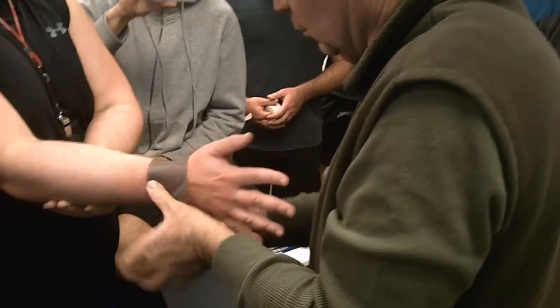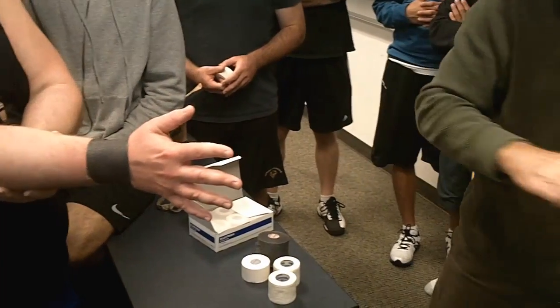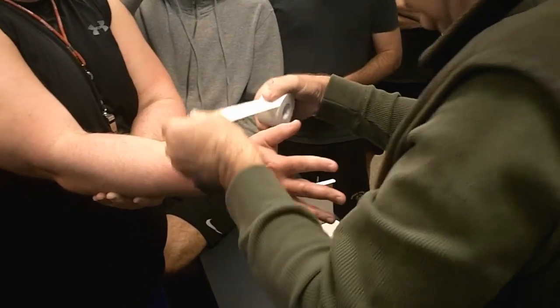We can use a little bit of elastograph. Don't let it move.